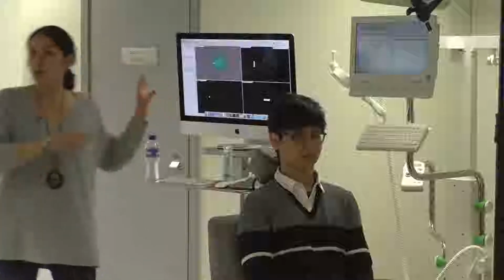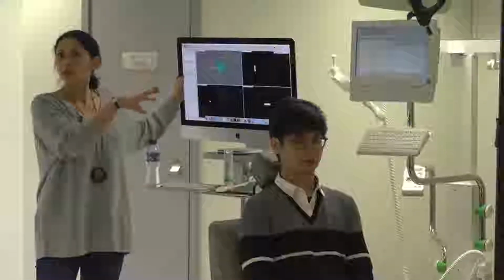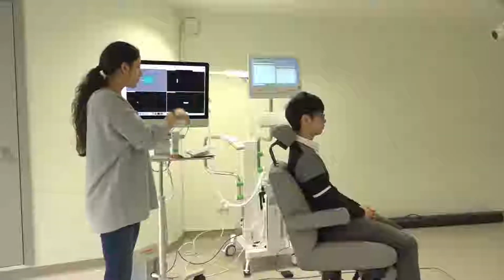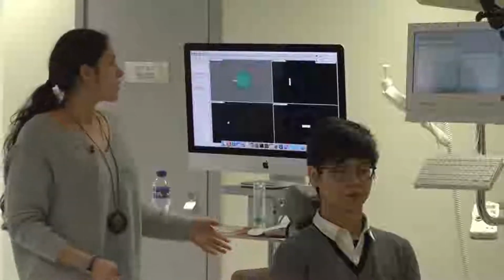You are familiar with the equipment, I think, because you were before in another course. Is it true? Are you familiar with the equipment? Not really. We had a demonstration once, but that was 1 year ago.